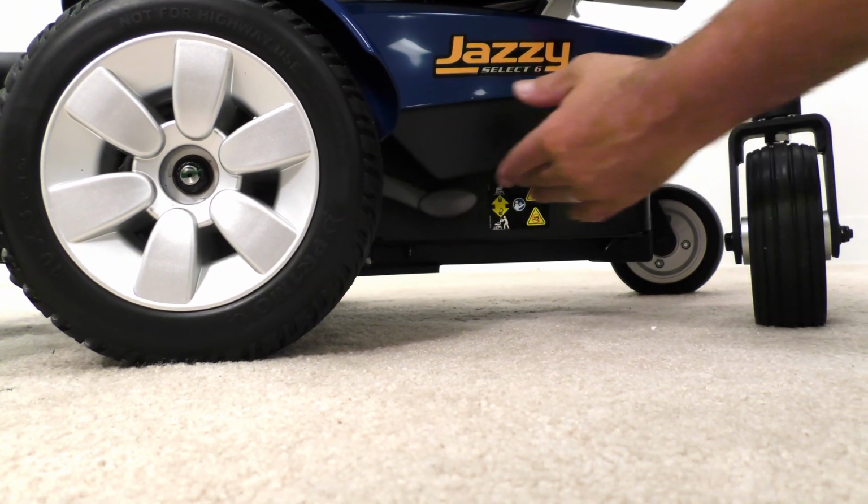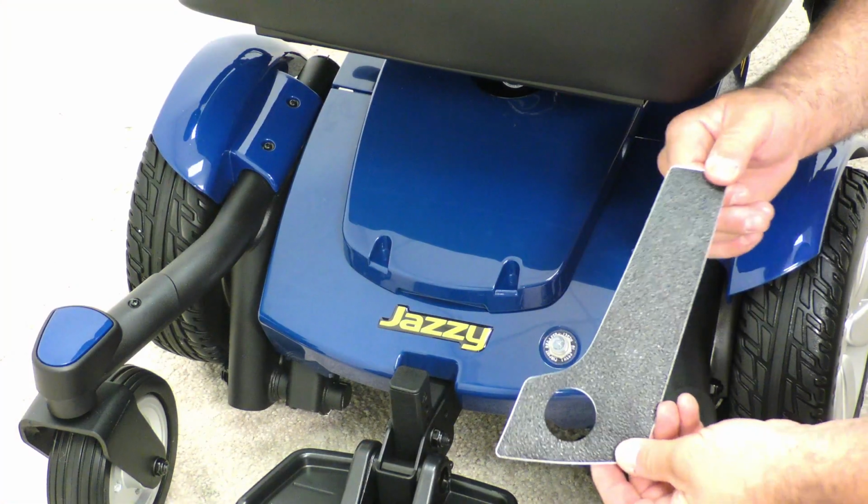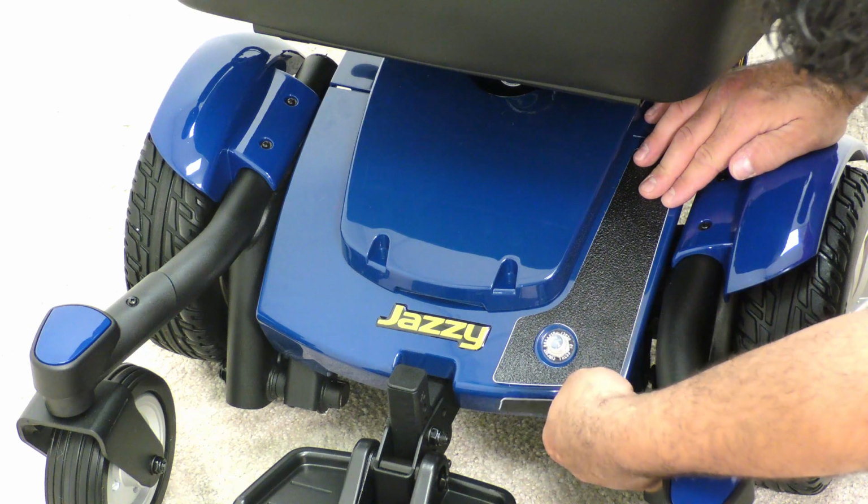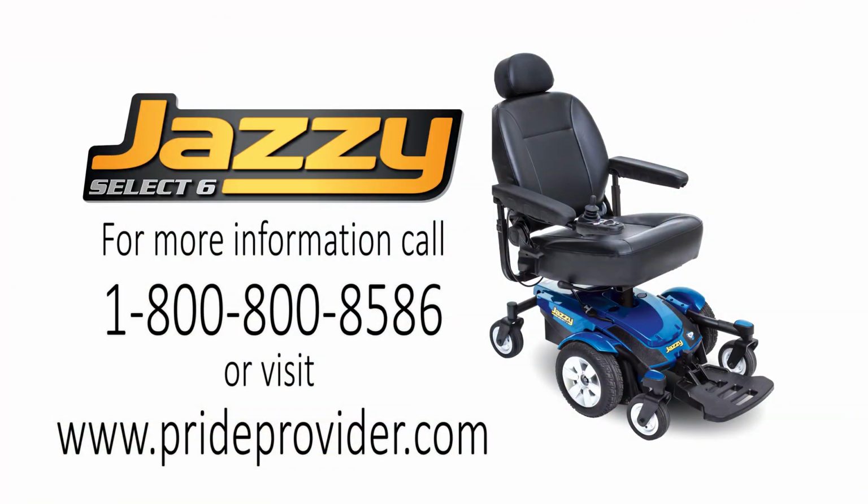Freewheel levers are located on each side of the unit. The optional scuff guards mount on the front of the shroud by the power access cover. That is the setup for a Jazzy Select 6.